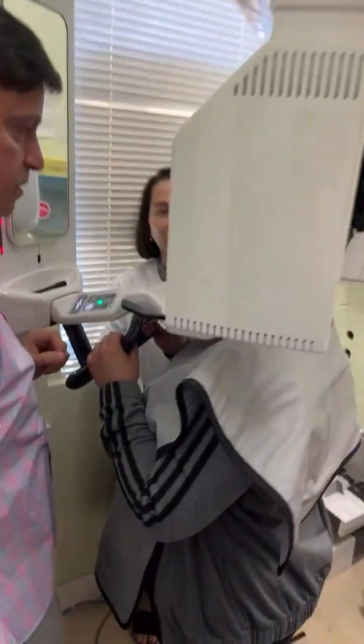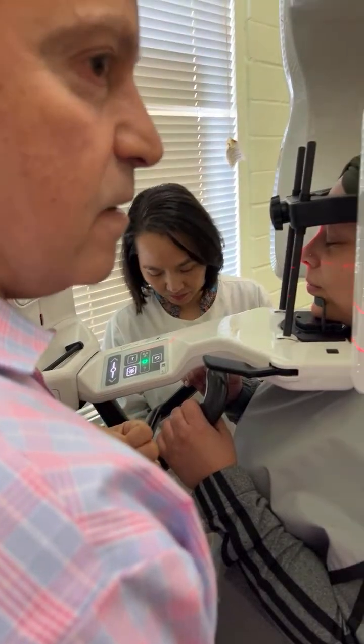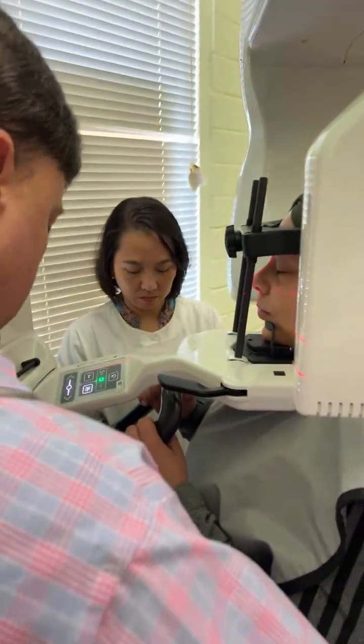Very tight. She's tight. That's what we want. She's going to be in here for 20 seconds, so she can't be moving around. If you have somebody that, like I said, moves and shakes, you're probably better off sitting them down. You can also move your feet forward a little bit.